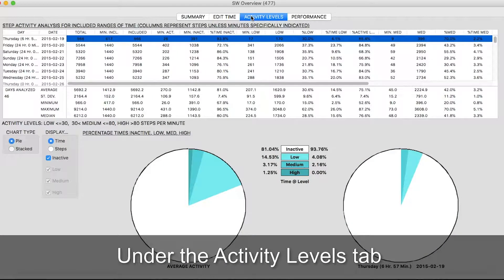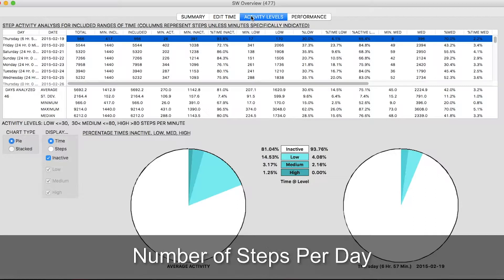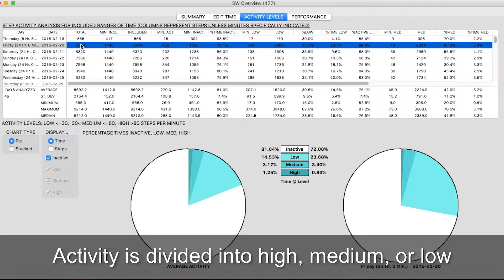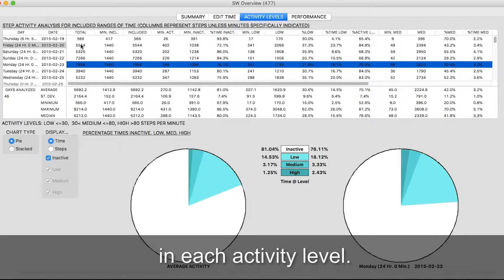Under the Activity Levels tab, you see the statistics for each day, including minutes included, number of steps per day, and percent of time active or inactive. Activity is divided into high, medium, or low, and shows the percent of steps and time in each activity level.